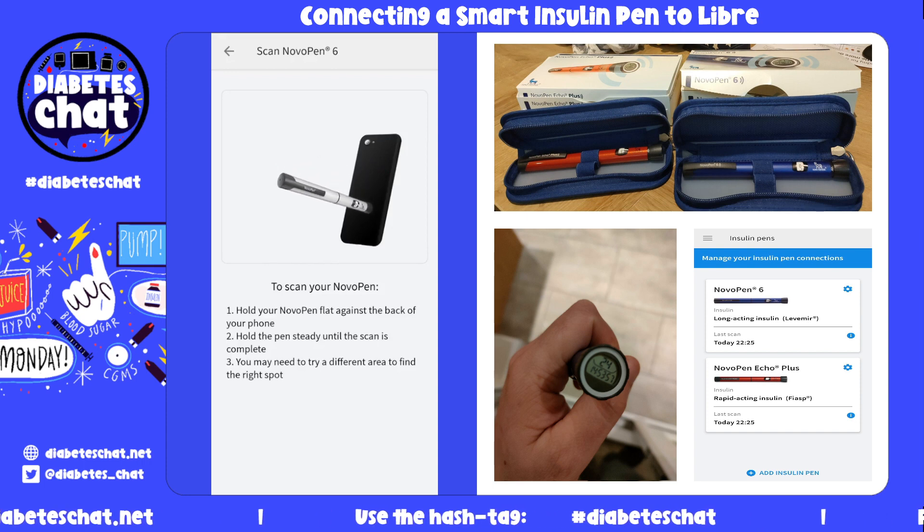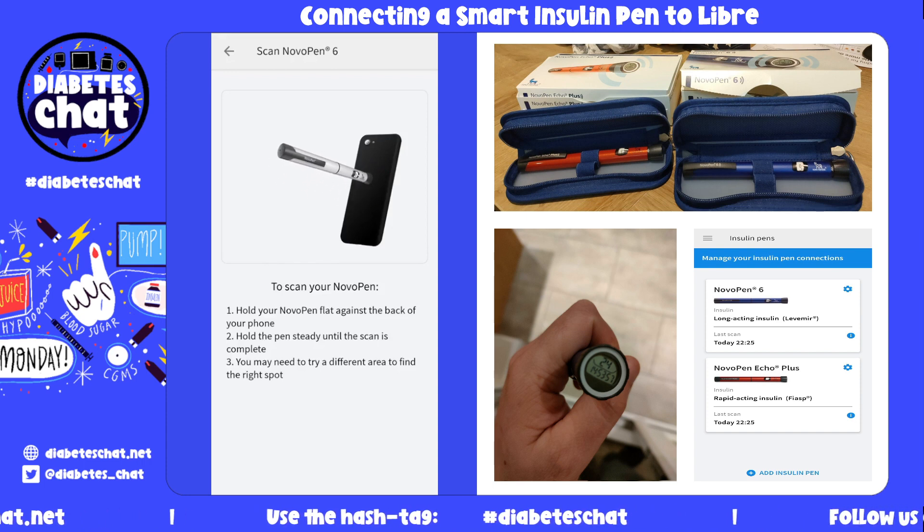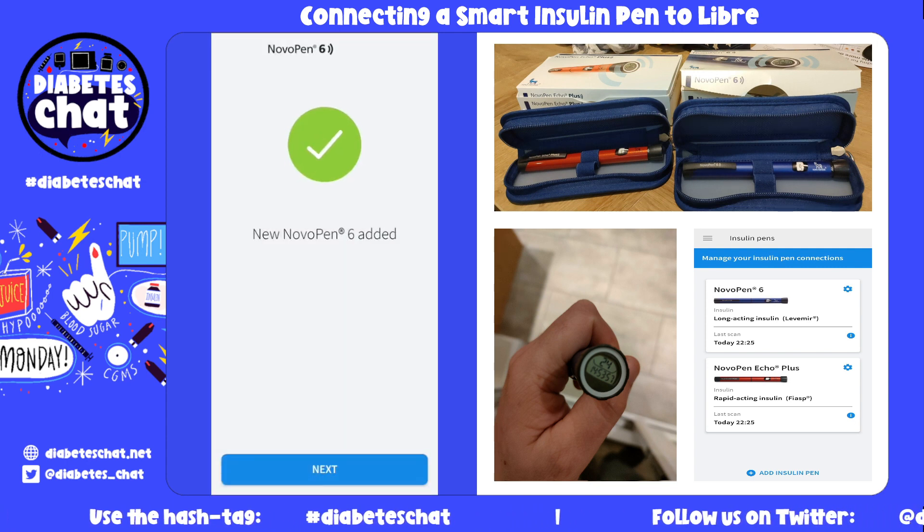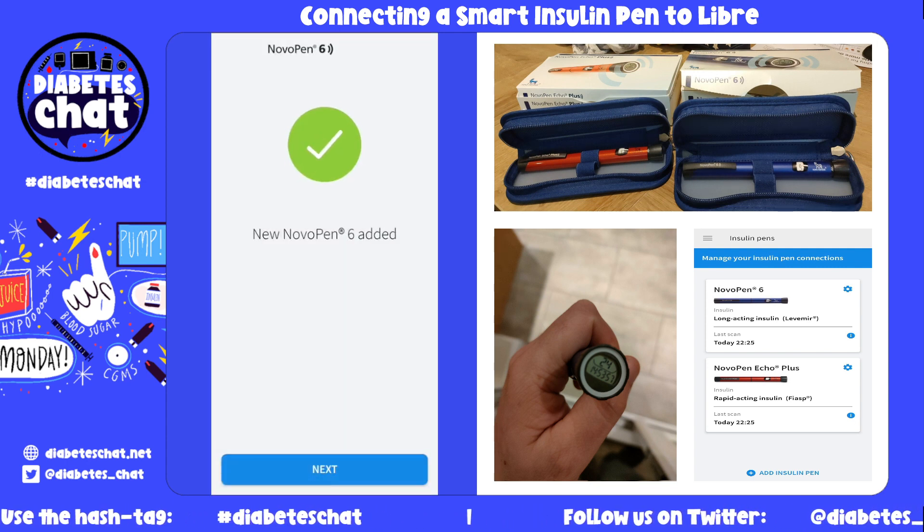I'm going to get my Novo Pen. I'm going to click down the memory mode, hold it on the back of the screen, and you can see it has been added.